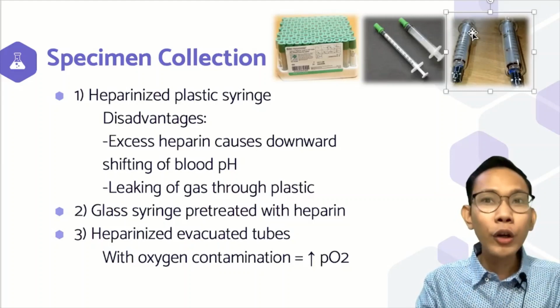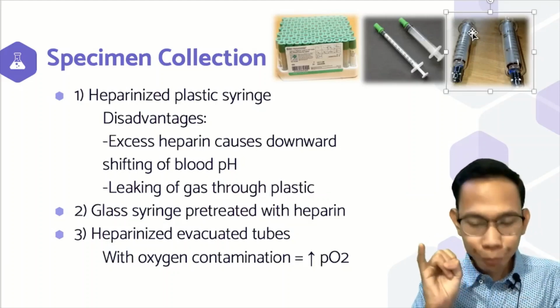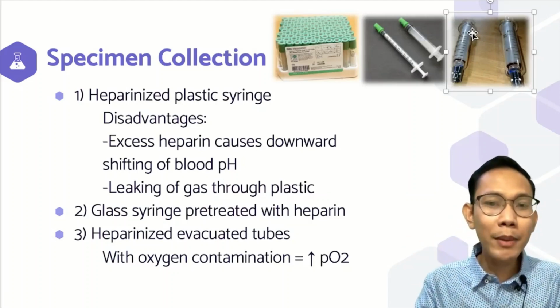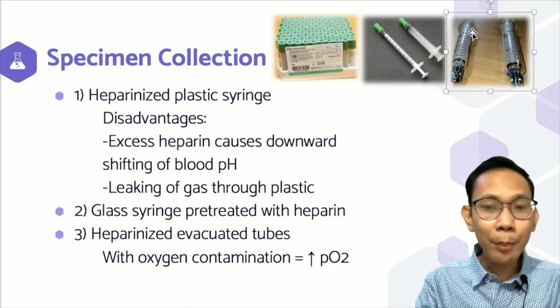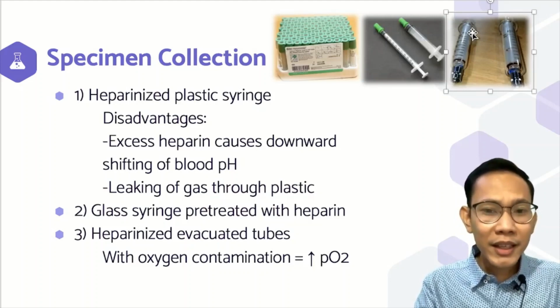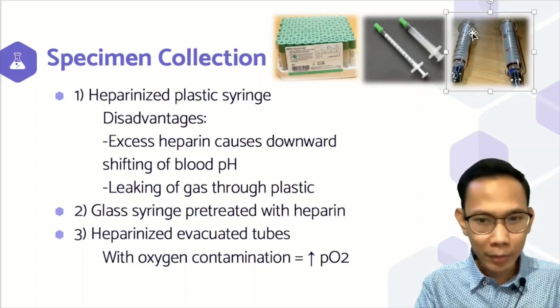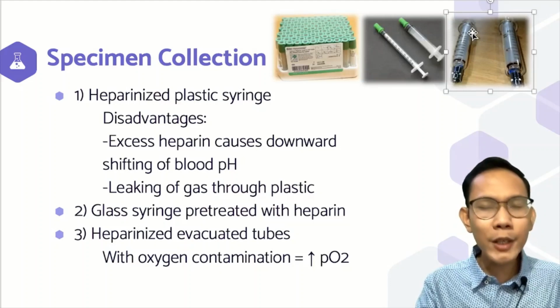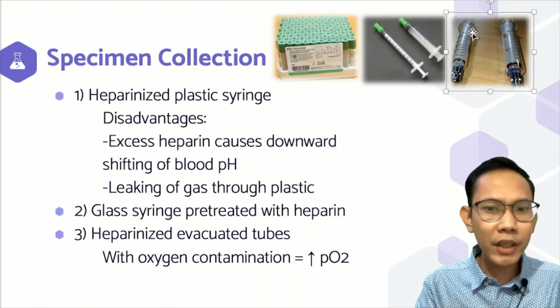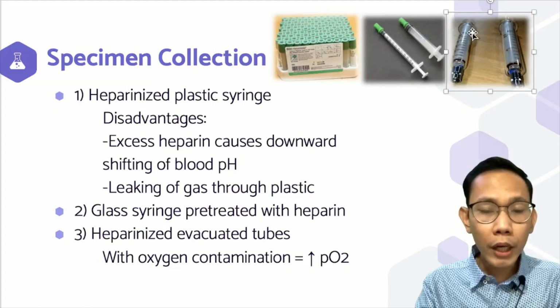But in terms of collecting blood samples for, for example, CBC or clinical chemistry, of course, you should not collect the sample from the arteries, because your machines are sensitive to that. Usually the machines detect venous blood, not arterial blood. Of course, there might be only a few differences in the result, but again, we are not trained to collect arterial blood samples. So it's either your RT or the physician who must collect the sample.